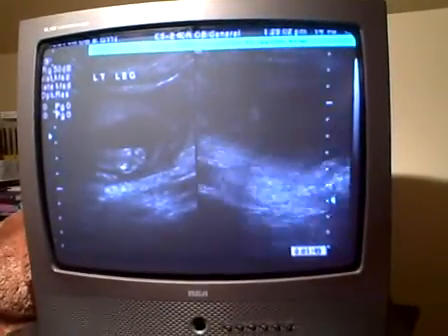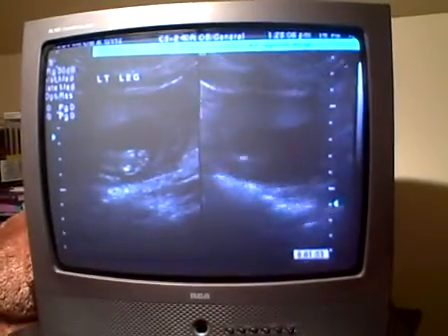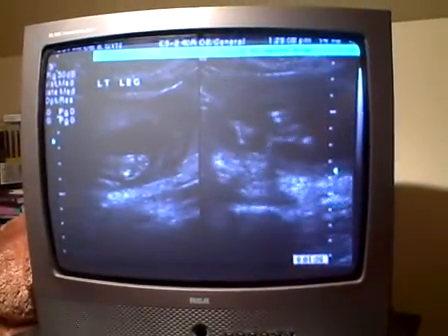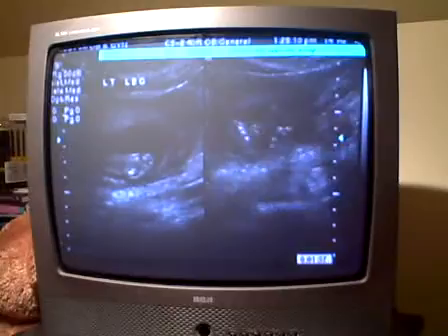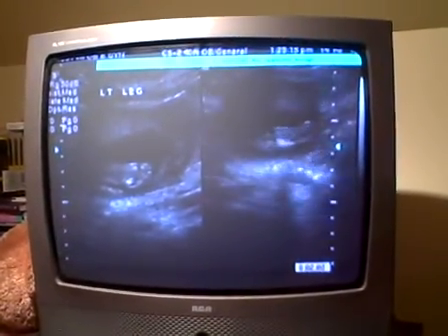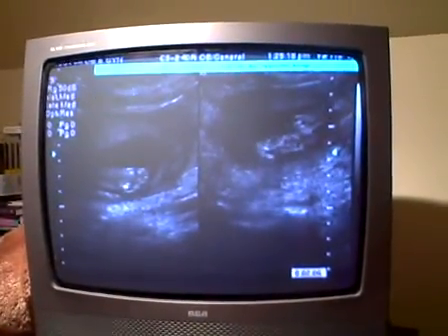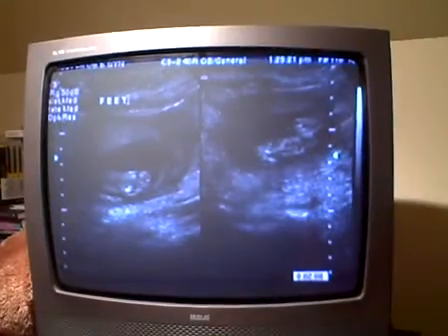There's both feet. She's going to zero in on one of them. You can see both feet, but she's looking for one. That's pretty good. Those are feet — one each.